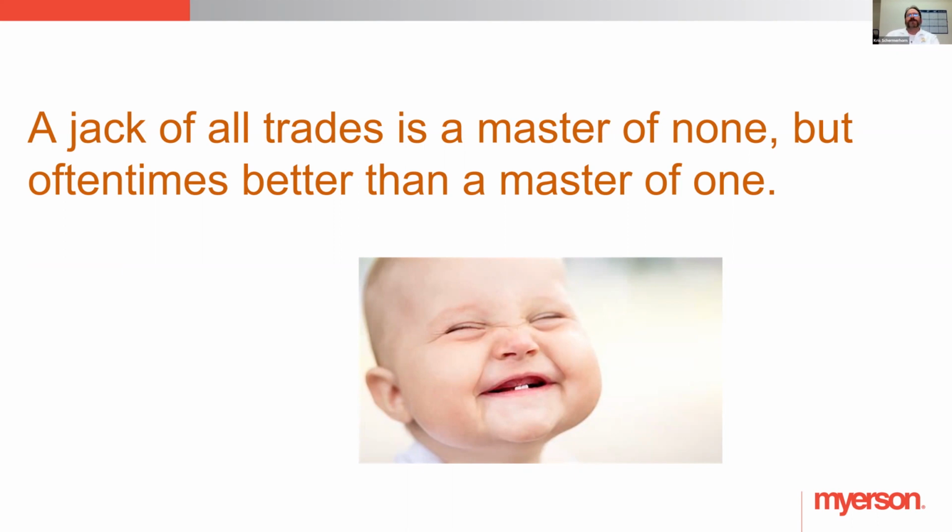And I've done repairs, like I've been experimenting with the denture base, and I've done a few partials, and I've actually incorporated clasps into those partials, and then I had to repair them, right? Because it was a metal clasp. So I had to make a trench, and I had to set it in there. And when I bonded acrylic, I took the fibers out, right? Because we don't have fibers in something we print. And I couldn't see where one started and stopped. I couldn't figure out where it was. There was no line of demarcation. There was just no evidence. So my experience is it bonds pretty much like acrylic bonds to acrylic. So I've been very happy with that.